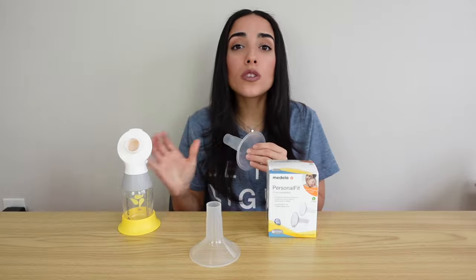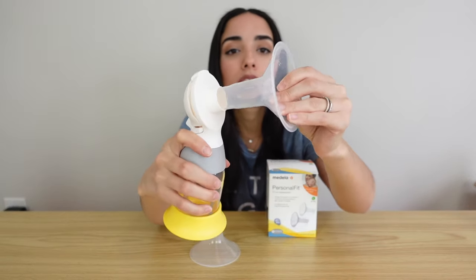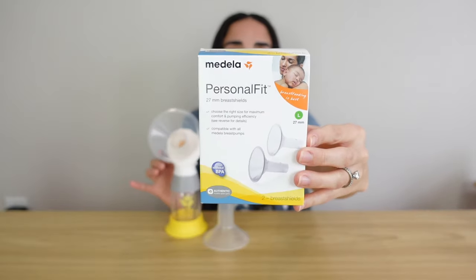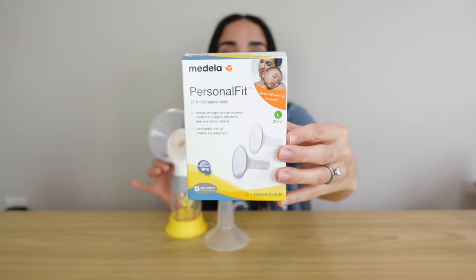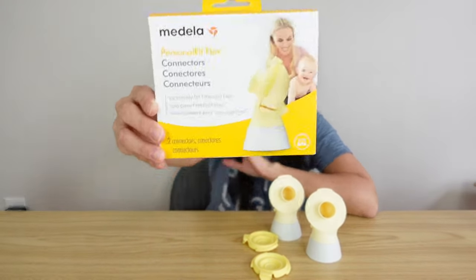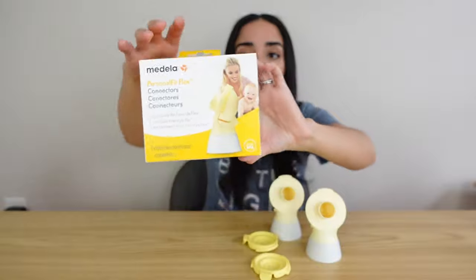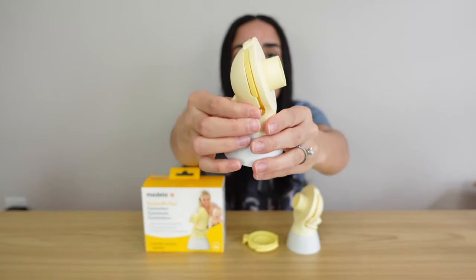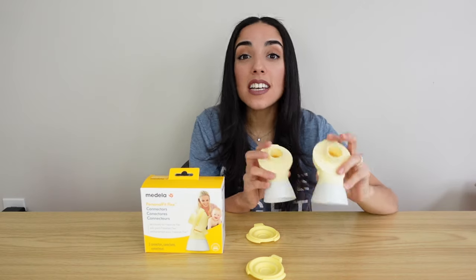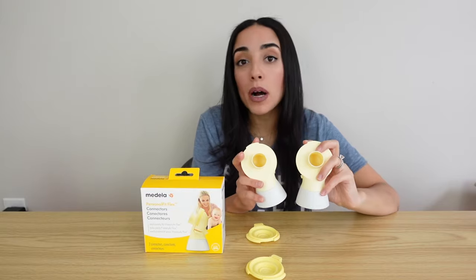Also with this pump, their personal fit flanges will fit right into the connector pieces. If you prefer pumping with that style flange, you can purchase a two-pack for about $15. One other quick thing — the Freestyle Flex connectors are actually compatible with the Pump in Style. I purchased a two-pack of those for about $30, and they come with two connectors and two membranes. So if you have the Freestyle Flex, those connector pieces will work with your Pump in Style.